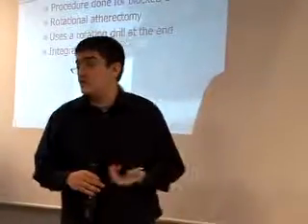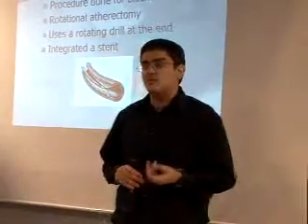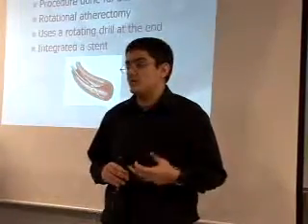We've integrated a stent into our procedure to streamline the process and to illustrate the concept that we developed: what if the rotablator, which is the drill at the end of the catheter, is the stent? What if the stent is the rotablator?